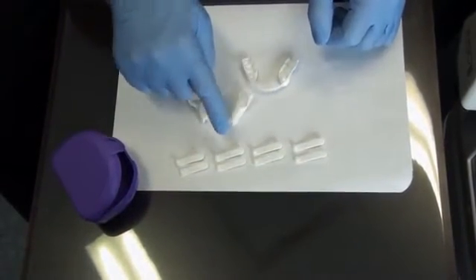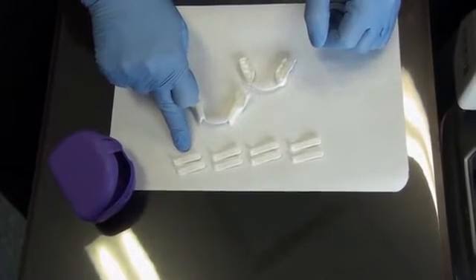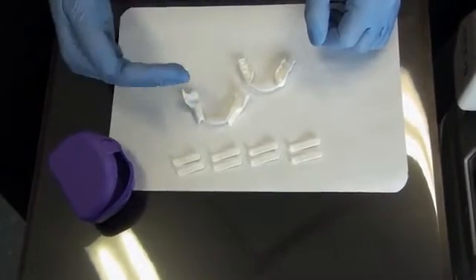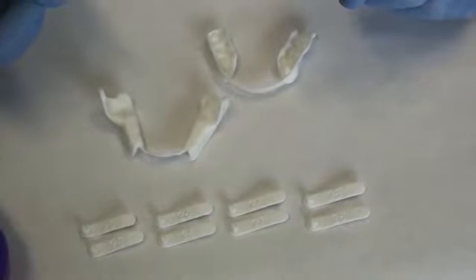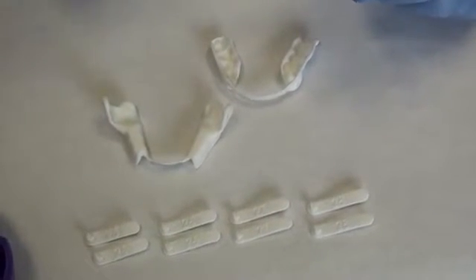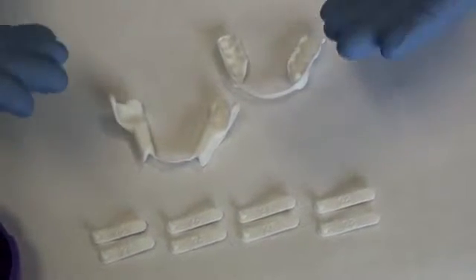Upon delivery, the device includes four rods. The shortest rod, in this case the 25 mm rod, corresponds to the maximum position registered with the George gauge. Using this rod, we will validate that the position represents 100% of the patient's mandibular advancement.